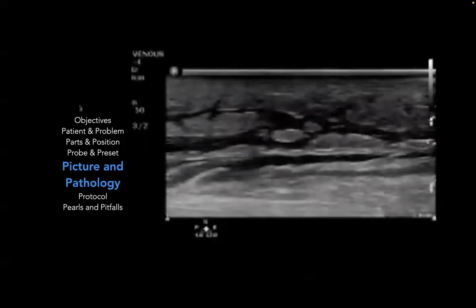And usually, by emergency medicine standards, we follow kind of a rule of thumb where if there is a fluid collection that's more or less more than a centimeter or so, then that could be amenable to an I&D. If it's less, there's not really going to be much fluid that's going to be output here. And so in this example, since there's still a lot of cobblestoning, this is not amenable for drainage.